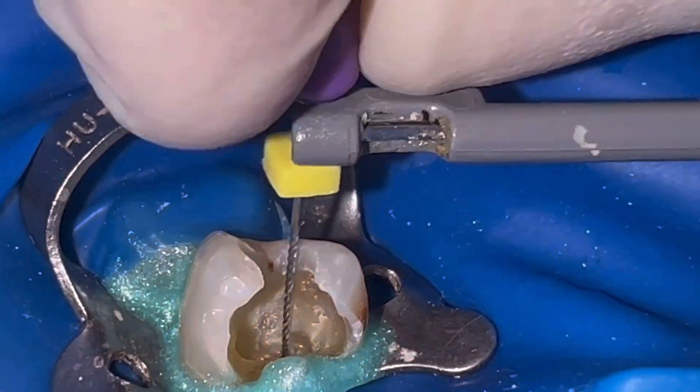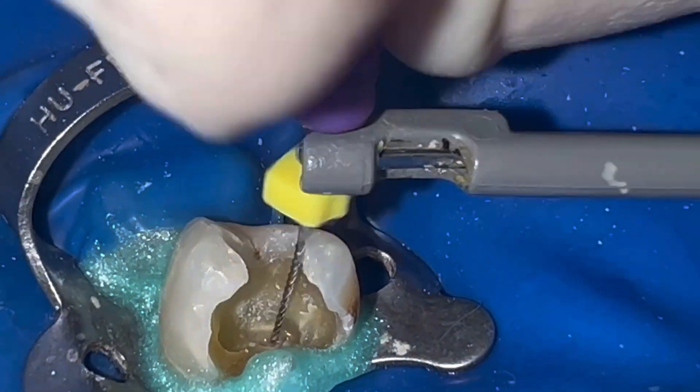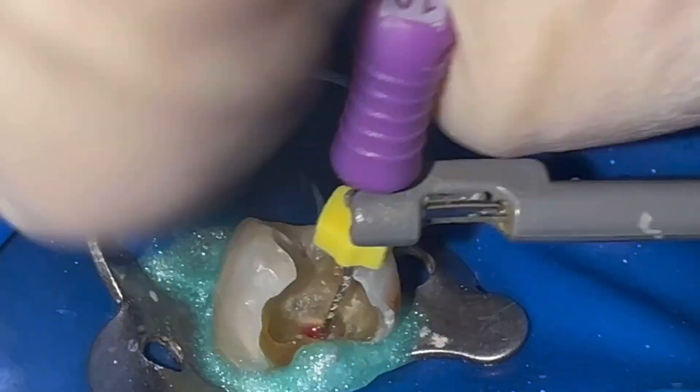We repeat the permeabilization and glide path in the palatal canal. In this one we were not able to reach the working length with a size 10 file, so we went down to a size 8.